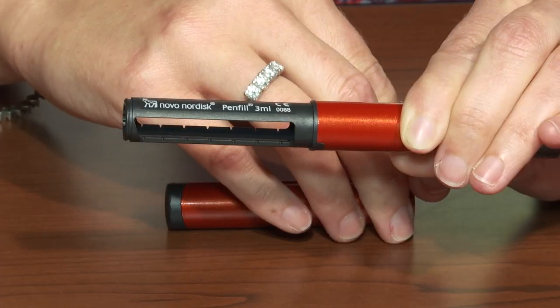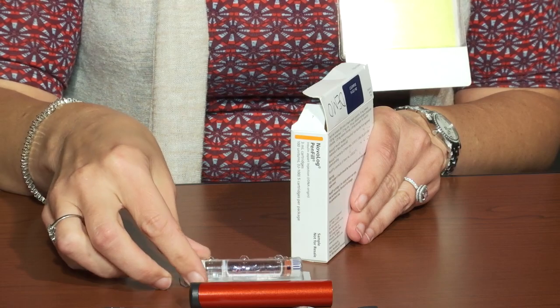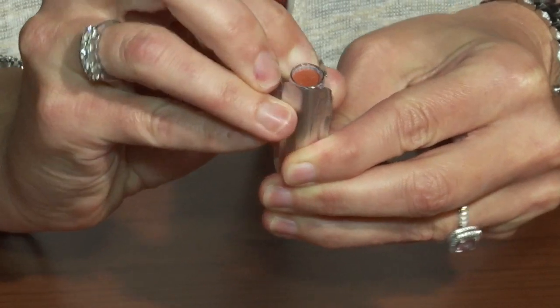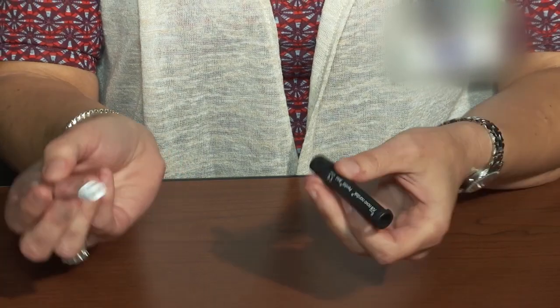Twist the cartridge frame from the pen and remove it. Remove the insulin cartridge from the refrigerated box and push the insulin cartridge from the blister pack. Now place the insulin cartridge in the cartridge frame.